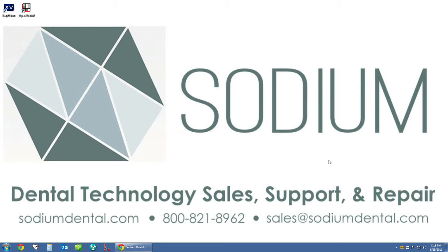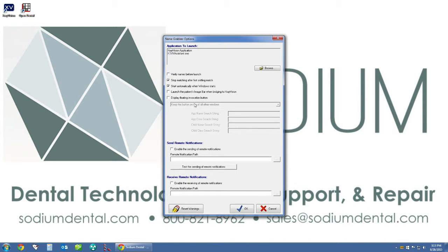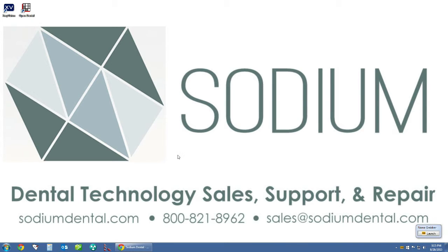An additional option we have with the name grabber icon is to actually make the name grabber icon float on our screen, as opposed to having to come down and click on this tiny little icon. If you feel that this icon is too difficult to use, we can simply right click on the name grabber icon, click on Options, and then under Options check the box next to Display floating invocation button. Click OK, and you can see that name grabber now has this handy button which is larger and a bit easier to select.